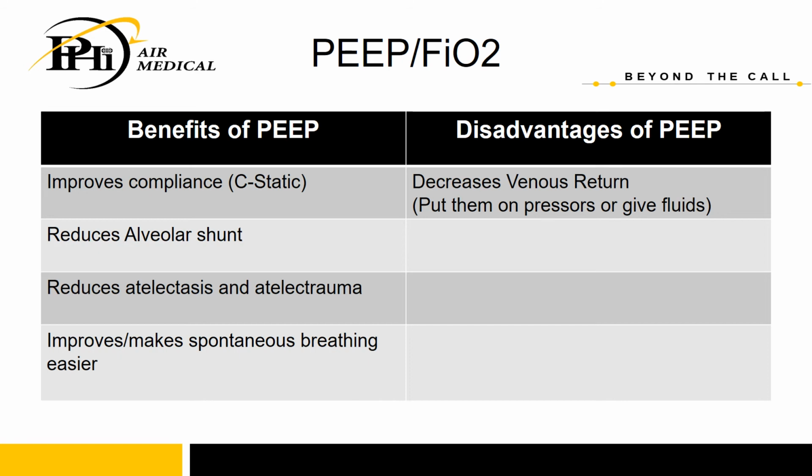Whereas if we give them 8 of PEEP or 10 of PEEP, it's going to be a lot easier for them to open it up, as all of their little balloons are already half opened or half full, so it's much easier for them to take that spontaneous breath.